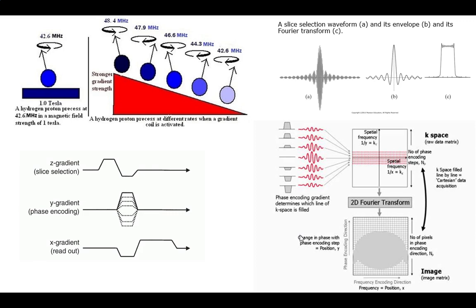I start the spin variation, hit it with the RF at whatever I want, 47.9 megahertz, for instance. If that's the frequency I induce from the RF coil, only that one near 47.9 is going to be spinning. The other ones will not get the energy from it. They don't resonate. So if you kind of just think of it as a resonance situation, that's the whole trick.